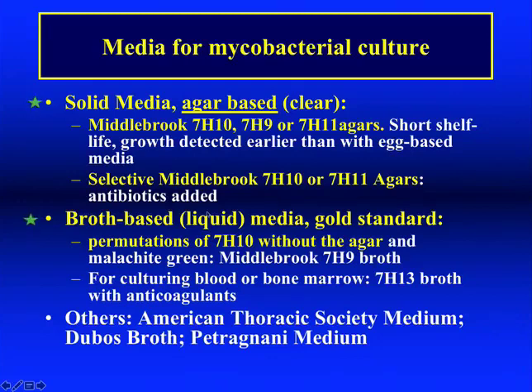And the third and last of the media types is the broth-based or liquid media, which is the gold standard, and we are required to have a system that has this and then one of the other ones as a backup. And the broth in these systems is a permutation of Dr. Middlebrook's 7H10 without the agar.